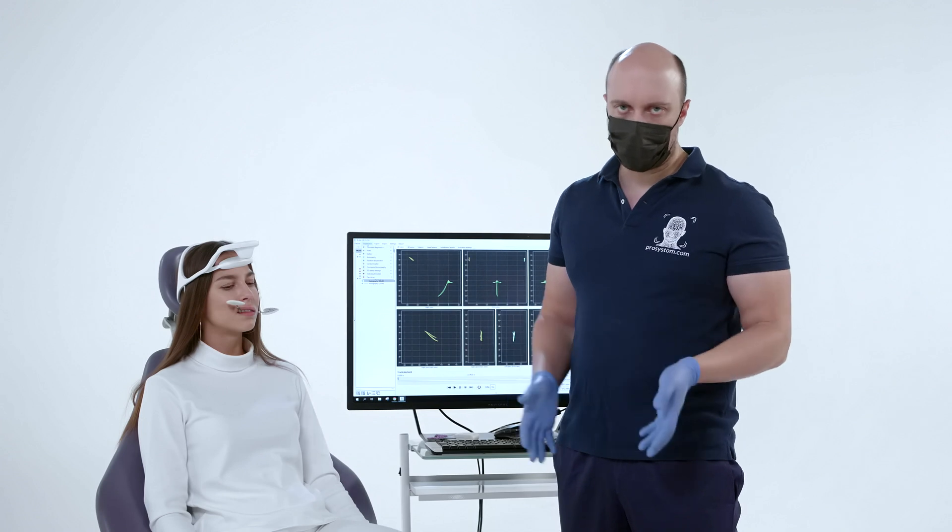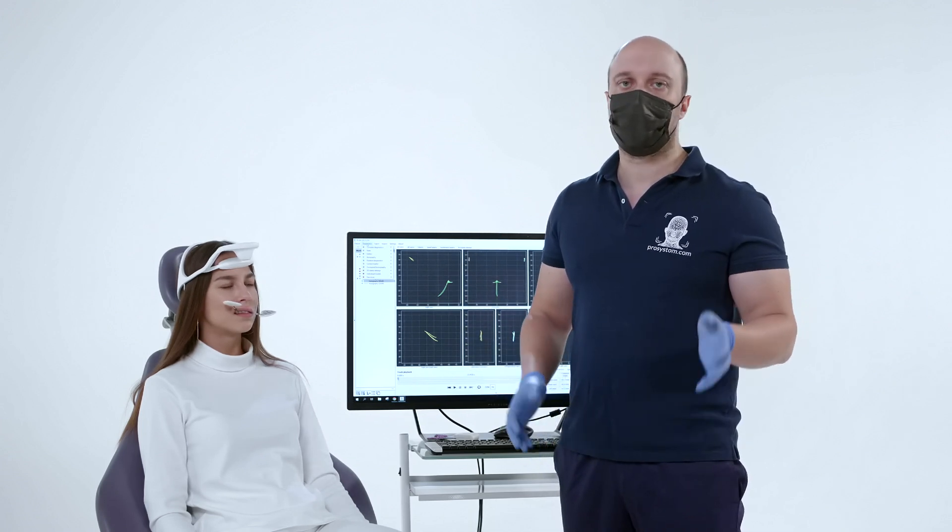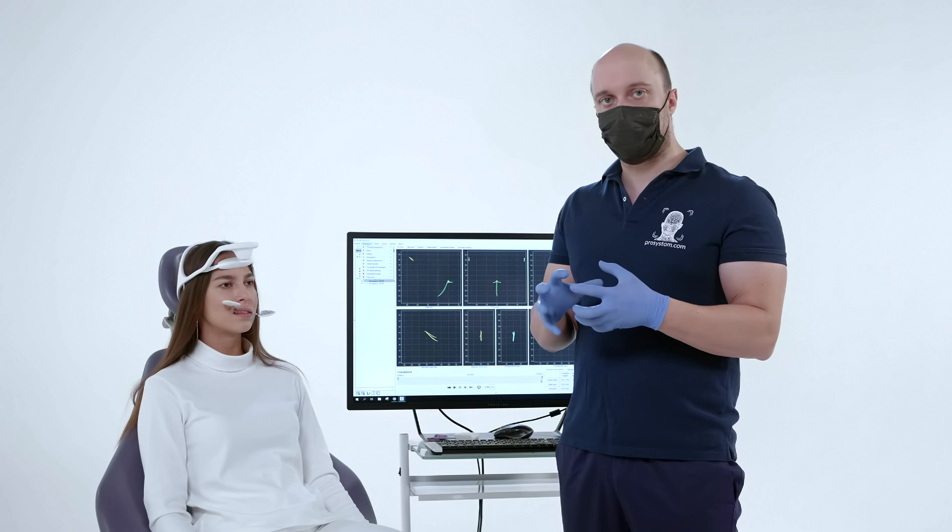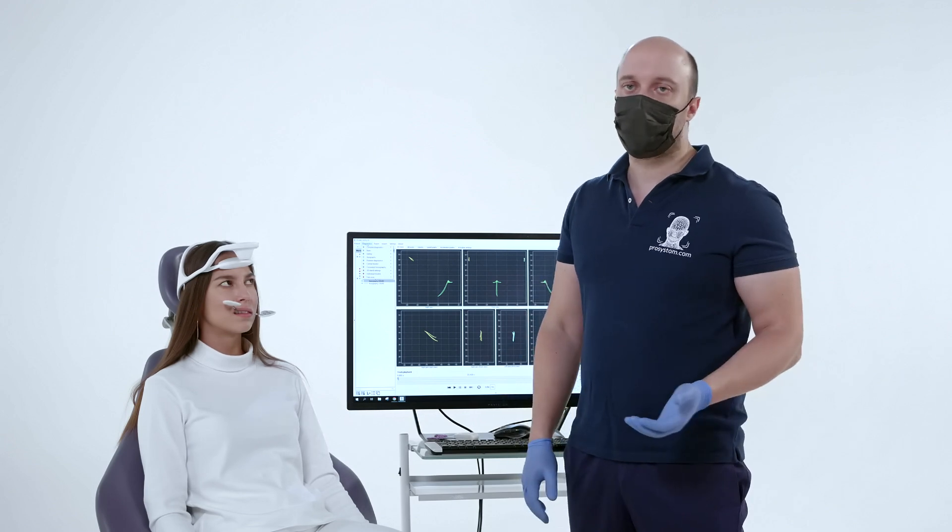In the program at this stage, you can load additional studies: computed tomography, face scan, and scans of dentition.